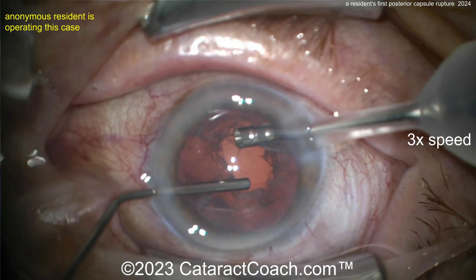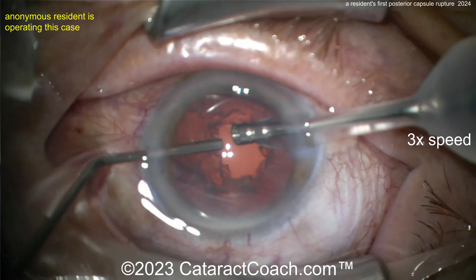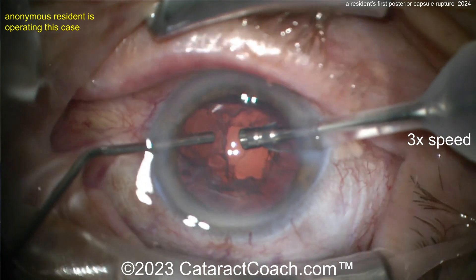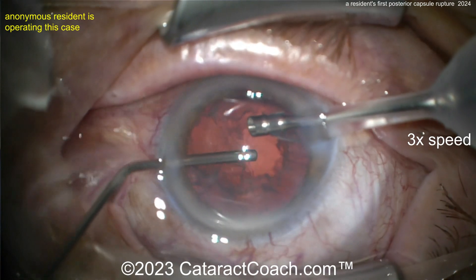We need to do some additional management, and the challenge is there's still so much lens cortex remaining. Don't over-pressurize things, because remember that started off as a small hole in the posterior capsule — now look how big it is. It will keep expanding.